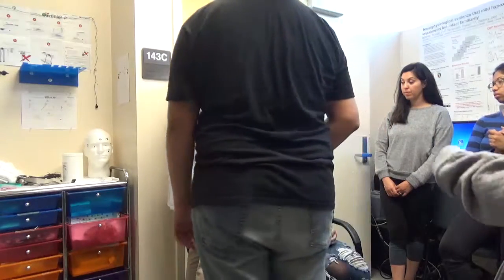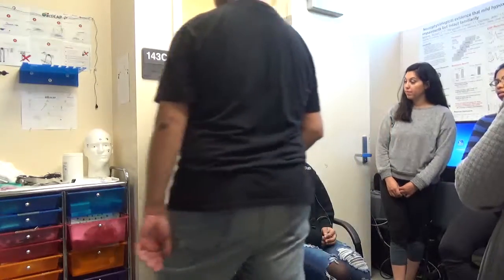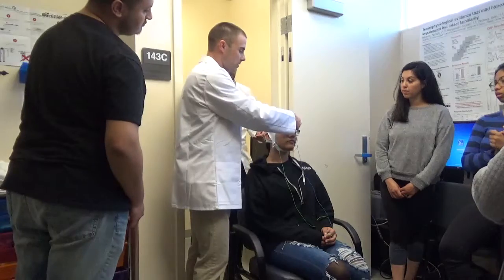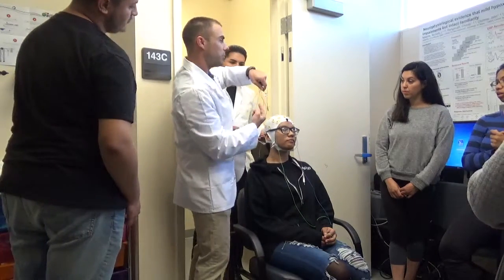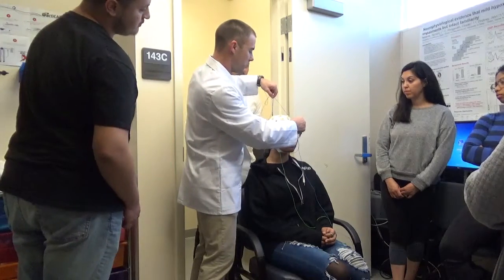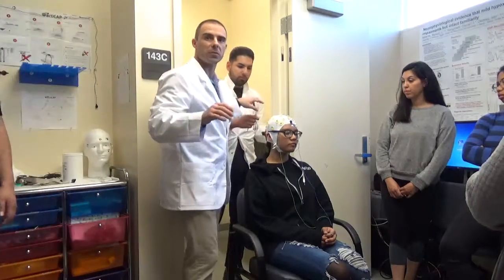And one of the things you would do here is see how this is on her eye? Here, watch out. Can you step aside? So you see how this is hanging over her eye? What we would do is actually set up the sticker so that the wire itself feeds upwards. It's a really good example of proper placement. Good job.